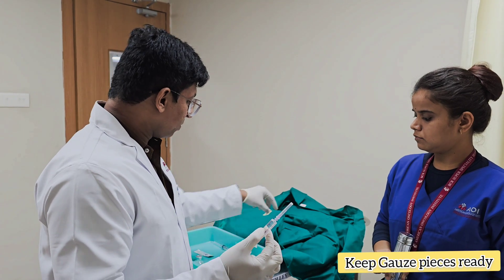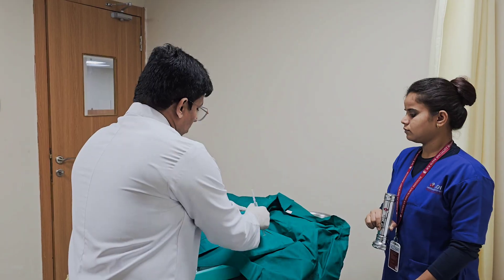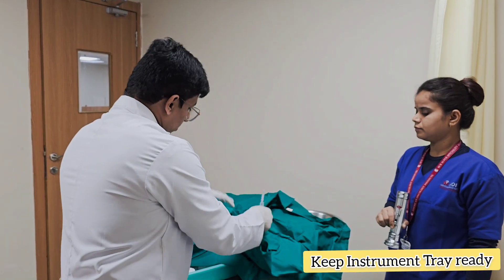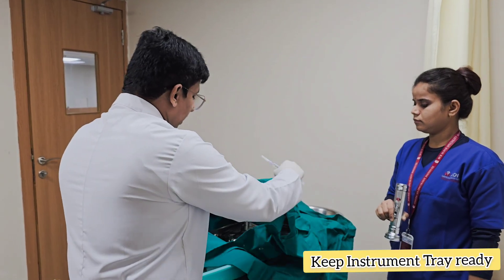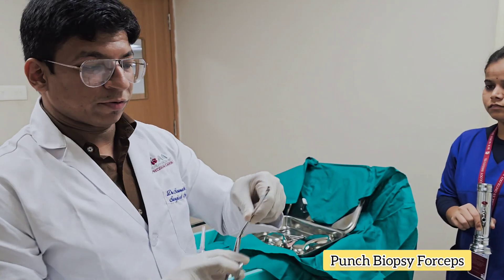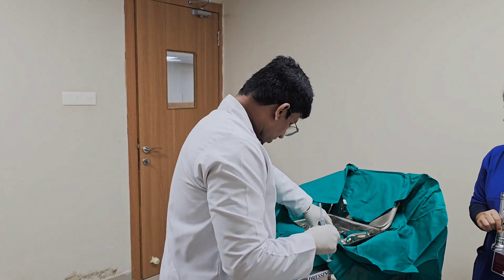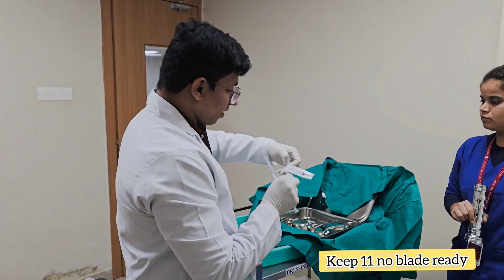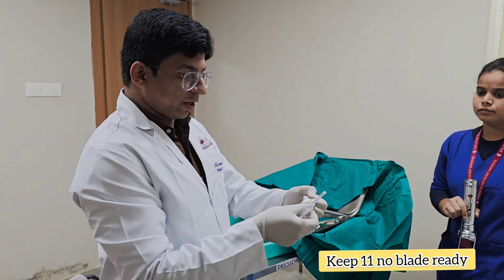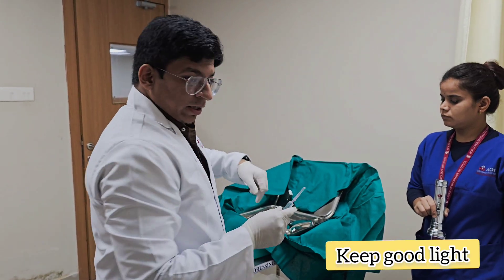We keep enough number of gauze pieces. The tray consists of a biopsy forceps — this is a punch biopsy forceps. Apart from that, we keep an 11 number blade ready if we want to use it.